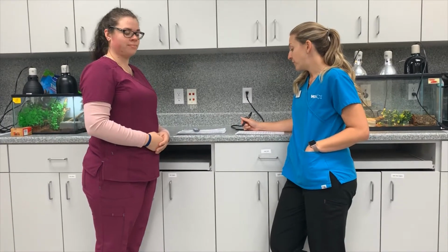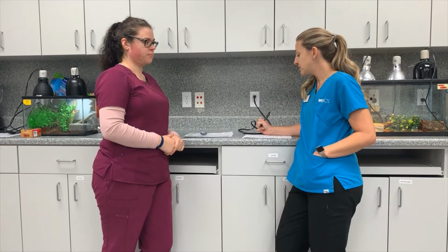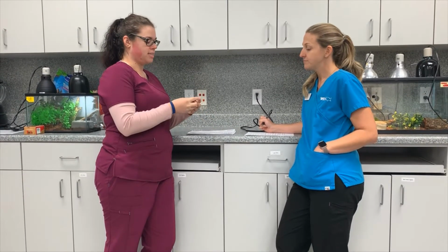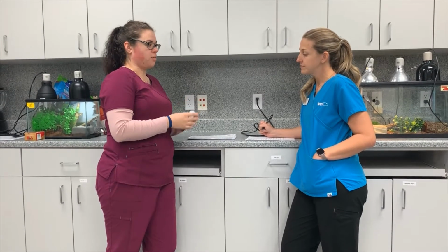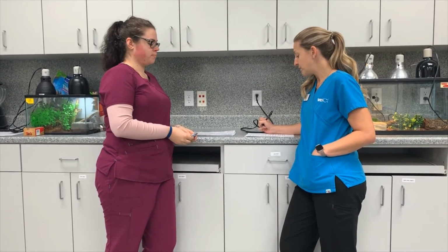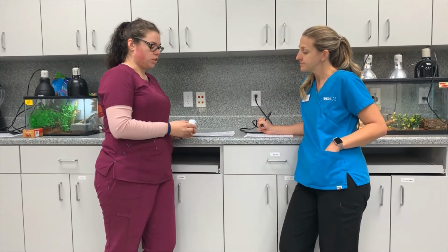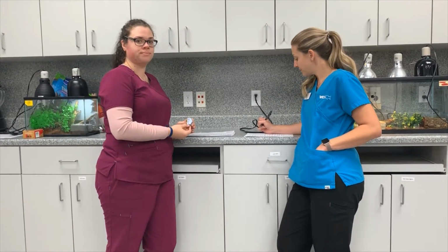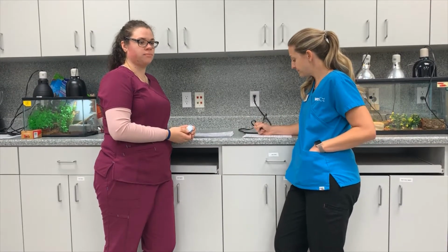What is the radiation monitoring device called? A dosimetry badge. How does it work to measure exposure to radiation? It has a device inside of this small package with a clip on the back that is affected by the radiation. How do we obtain the readings? We send these off to a company in which they obtain the readings for us and send back a quarterly report. When should it be worn? Whenever you are exposed to radiation.